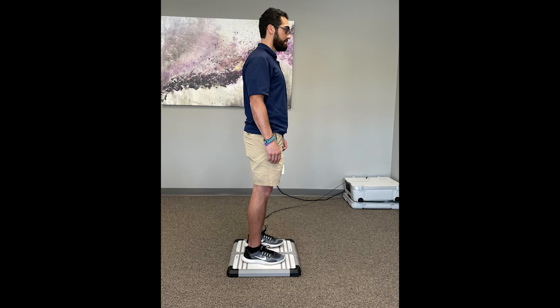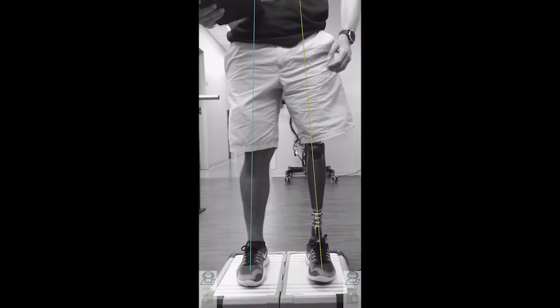We will now look at some images from real-world application and discuss what is being shown. In our first example, this is what would be considered ideal static alignment from a frontal view based on the recommendations of the LaserPosture. You will notice a green and a blue line — each line represents one of the patient's limbs. These lines show us how the patient is pushing into the platform. From this view, we want to see if the prosthetic foot is flat on the floor. If the patient has more weight on the inside or outside of the prosthetic foot, the corresponding line will originate from the side that is more heavily loaded. The practitioner can then make an adjustment to achieve a flat, evenly loaded foot. We are also looking to see where the line falls in relation to the knee of the prosthetic side — ideally, the line will run through the middle or roughly the middle of the knee, as shown here.